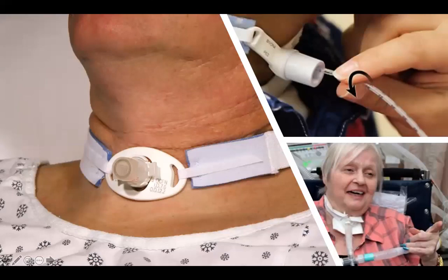This is how a trach would look from the outside. And this is a picture of a trach being suctioned. So as we said, that patient will not have that filtration system. They will have increased secretions. They will have reduced subglottic air pressure. They're unable to cough and clear out those secretions. So they might need some help with suctioning those secretions.